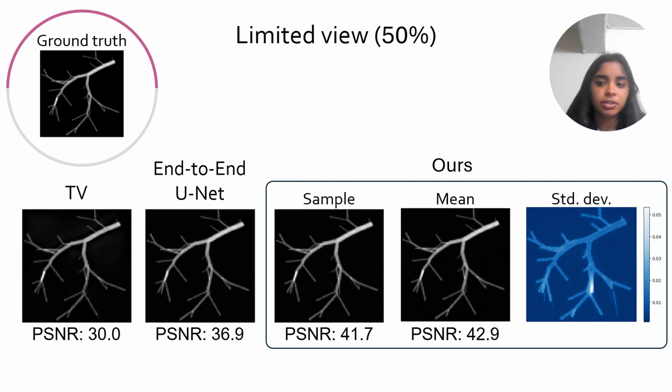Let's take a look at some results, starting with the limited view setting with 50% coverage. Our method outperforms both baselines, even the fully supervised method. An even better PSNR can be obtained by taking the empirical mean of our samples.